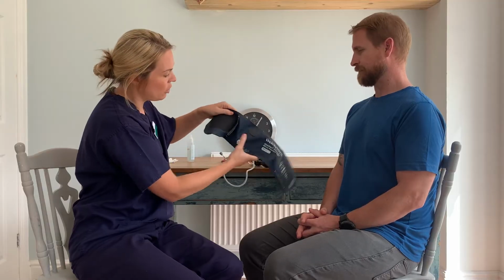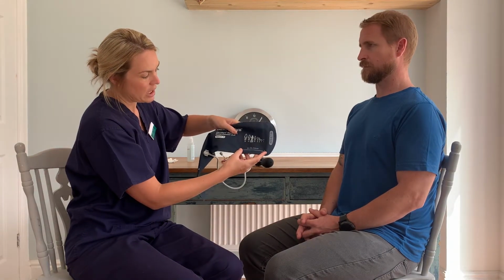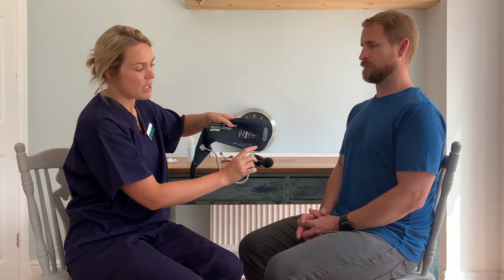Okay, so to start with, you just need to make sure that you have the correct size cuff for your patient. So you can see here, we've got an artery marker on the cuff, and we've got a line here. That artery marker needs to come within that line when it goes down your patient's arm, and that indicates that it's the right size cuff for your patient. So Dan, I'm just going to place this on your arm if that's okay. Do you have a preference in which arm we use?